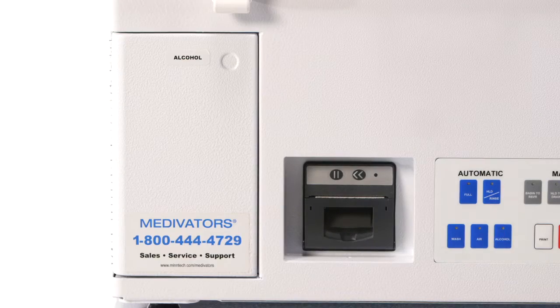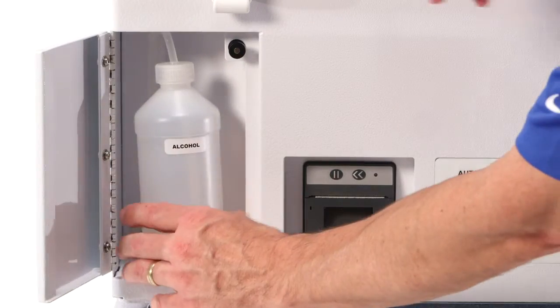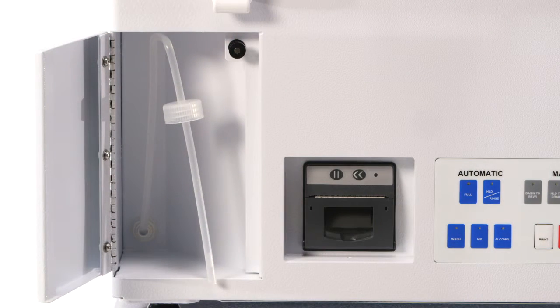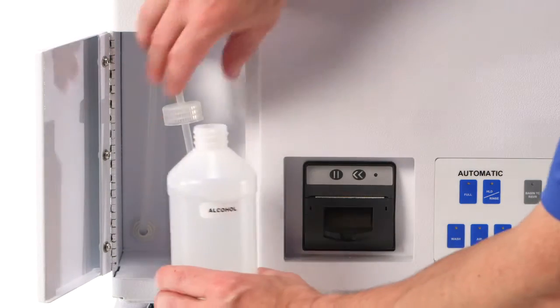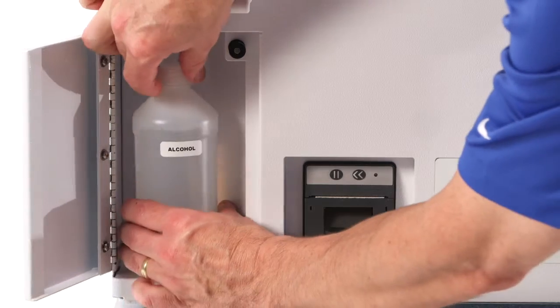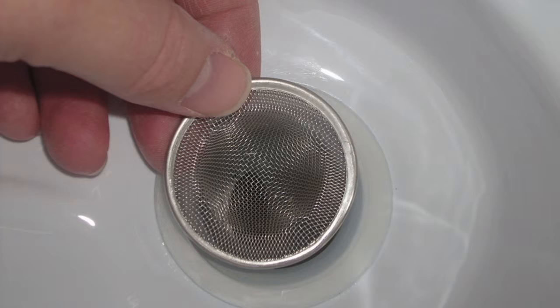The CER Optima uses alcohol for end-of-cycle endoscope channel drying. To open the alcohol compartment, press in on the small door indentation and then release — the door will now pop open slightly. Open the door fully to reveal the alcohol bottle. Refill or replace the 500ml bottle using only 70% ethyl alcohol or isopropyl alcohol. Make sure the drain screen cover is positioned over the CER basin drain; if shipping tape is holding it in place, remove the tape before use. Always use this drain cover to prevent any small endoscope parts from entering or blocking the drain, which could restrict or inhibit drain flow and system performance.